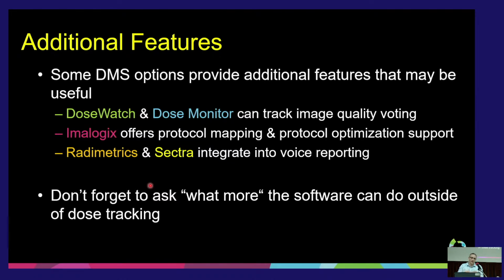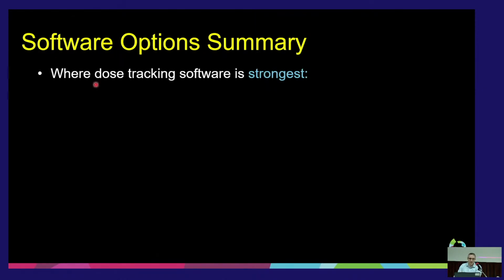For example, we might find that a patient was pregnant. We can put that into our system, and then that can communicate back via HL7 feeds to the HIS system. So you can actually get information in and out of patient records. It's a pretty interesting feature. The softwares are really evolving to be more than just simply showing dose data.